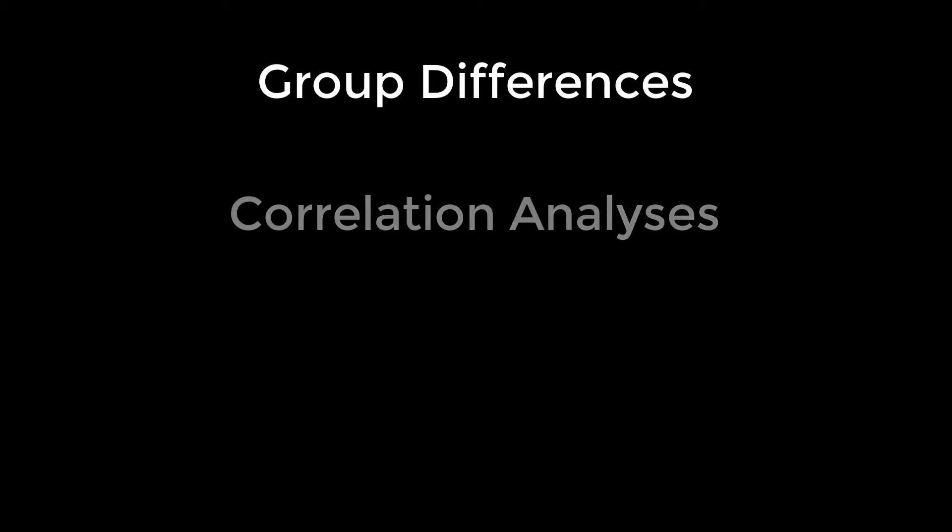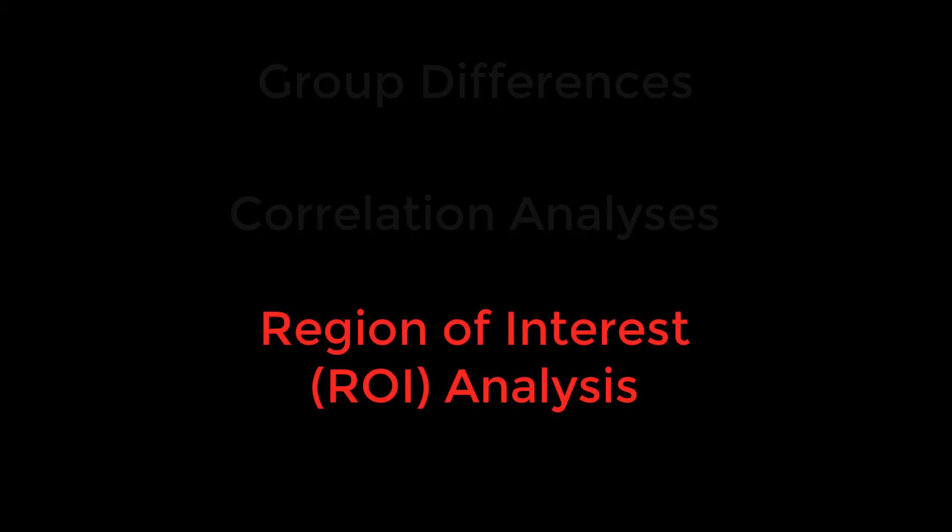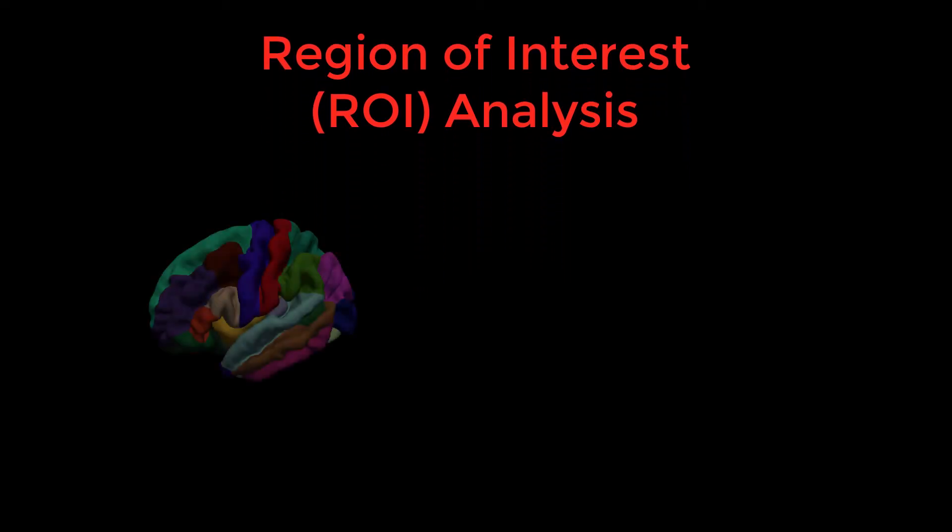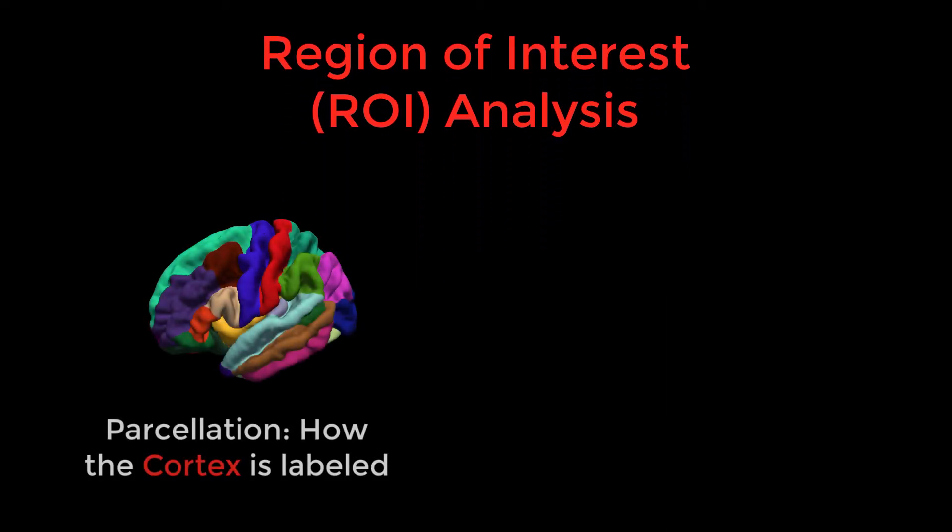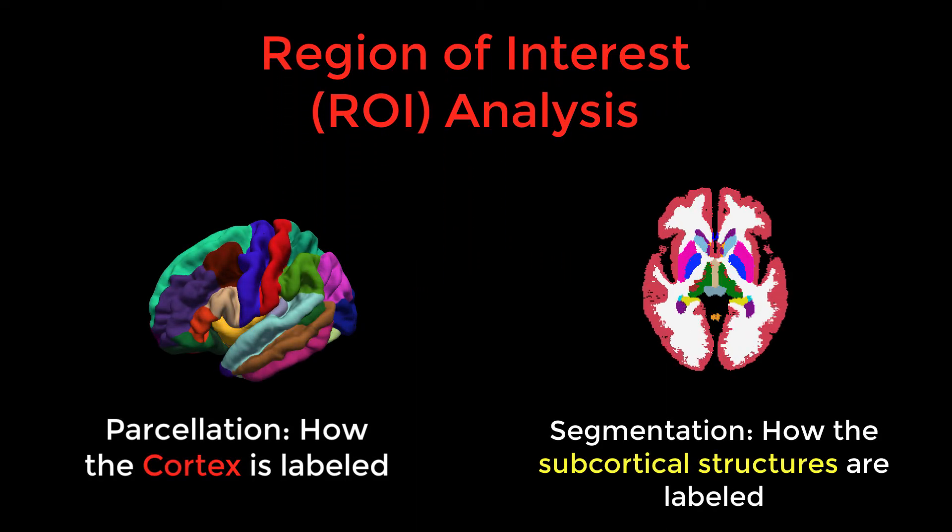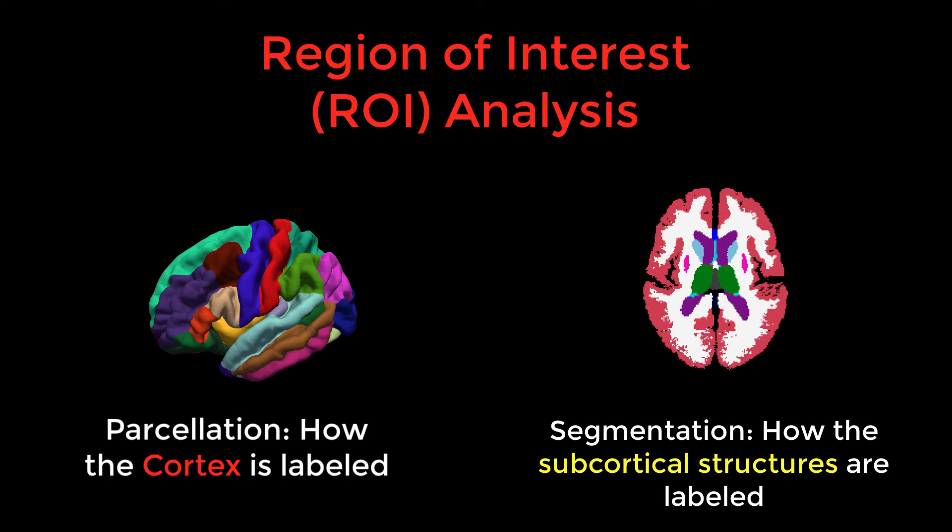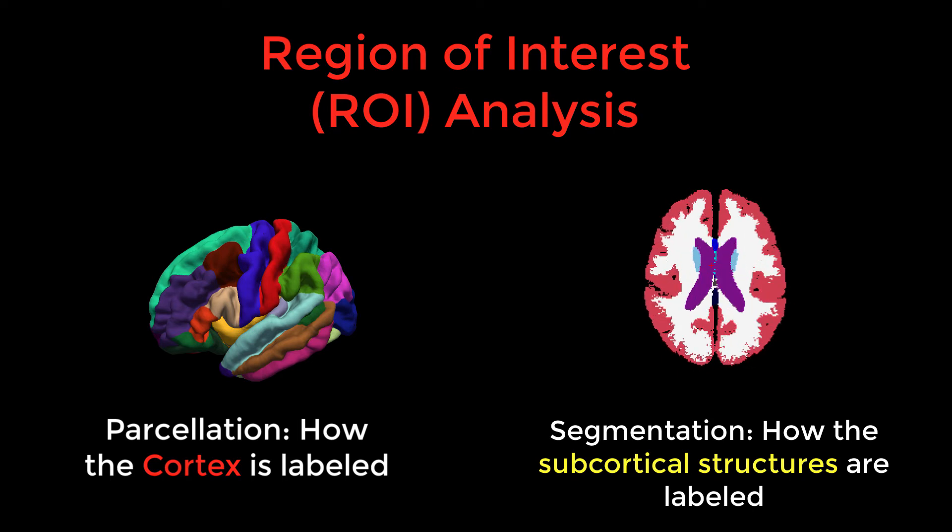So far in FreeSurfer we've covered group difference analyses and correlation analyses. A third method of analysis is Region of Interest, or ROI analysis. Recon-all parcellates and segments the brain into different cortical and subcortical structures.